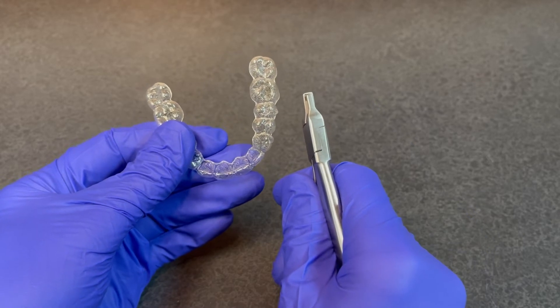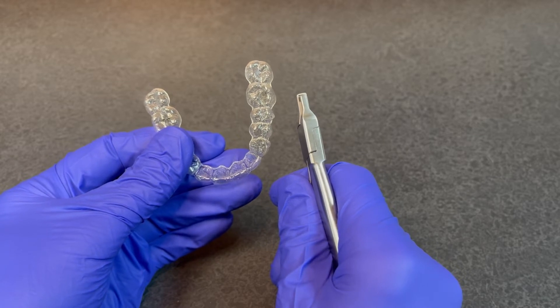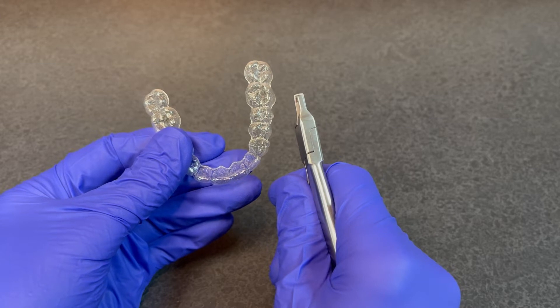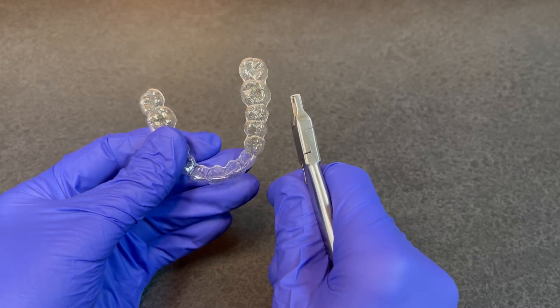After determining the type of rotation desired for the tooth you wish to move, you select either the counterclockwise or the clockwise wedge instrument. The direction of rotation for that specific tooth is determined by looking at the occlusal view of the teeth, and the appropriate wedge indent in the aligner is created.